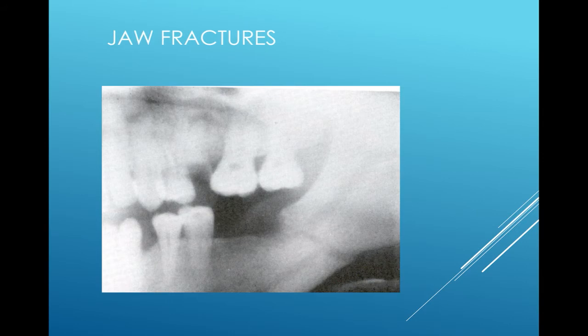Next, you can have a jaw fracture. Most commonly, this is going to be observed on the mandible, and you're going to usually diagnose this through panoramic radiography. On other radiographs, a fracture is very difficult to see, but when you can see a jaw fracture, you're going to see it as a radiolucent line through the bone. Maxillary fractures can be incredibly difficult to diagnose through a radiograph. So sometimes you can use an advanced technology like a CBCT, a cone beam computed tomography 3-dimensional scan, in order to get a more accurate diagnosis for a maxillary fracture.